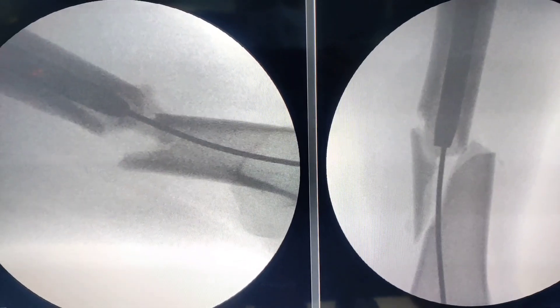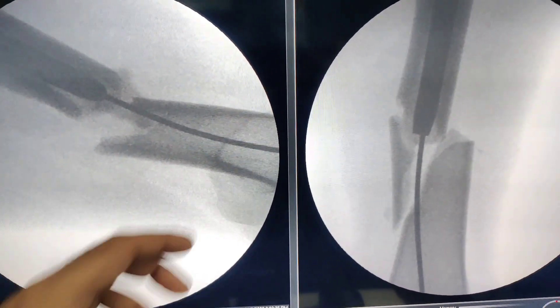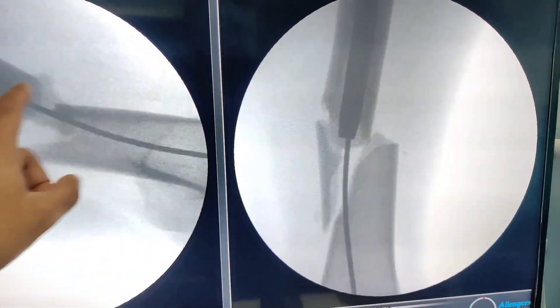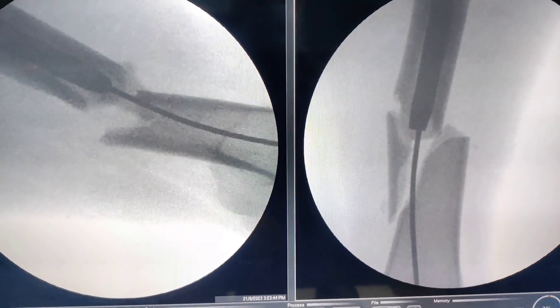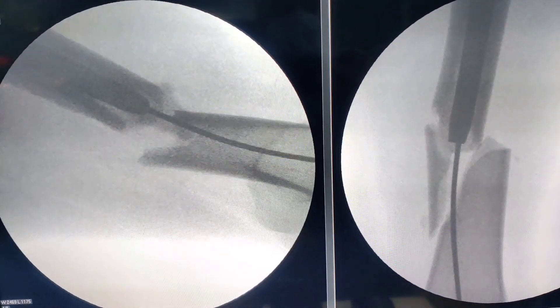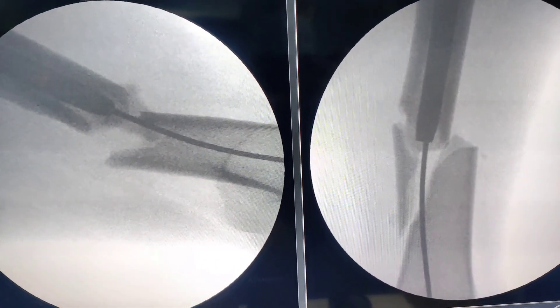When we are struggling and not able to pass the nail — because whenever we are passing the nail it is hitting the lateral cortex — trying to reduce the fracture becomes quite difficult. We will show you a trick which will help you a lot in reducing this fracture.